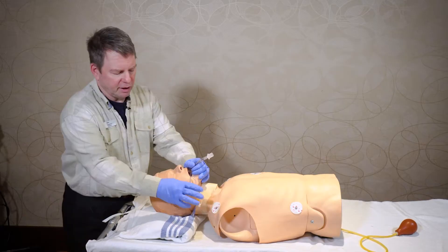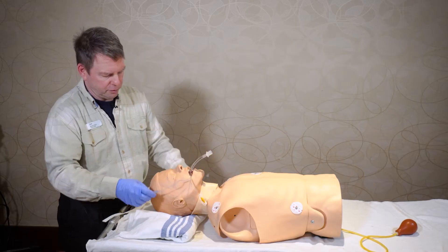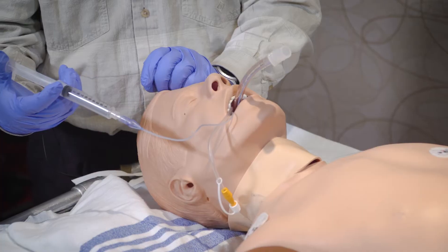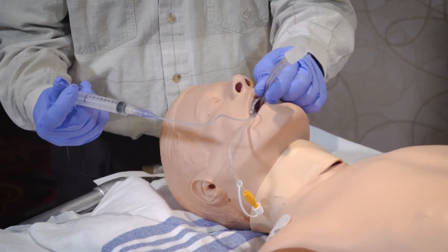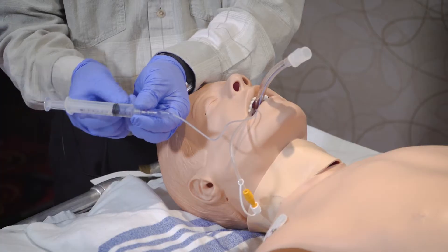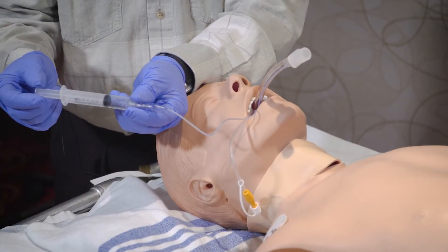This patient has just recently been intubated. When you're inflating the cuff with the syringe, you would inflate the cuff while somebody was securing the tube at the same time, and then do not leave the syringe on the cuff because if you do it will actually deflate by itself.